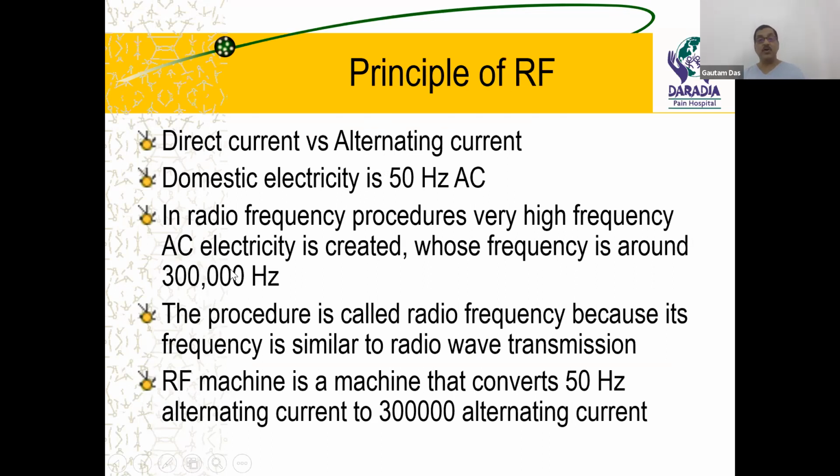So why is this called radio frequency? Because this frequency is basically in the same frequency band in which radio waves are transmitted, like when you listen to a transistor radio. The frequency band is similar to that, and that is why this procedure is called a radio frequency procedure. Sometimes some people get confused about why it is called radio frequency. Maybe like the radio you are listening to.